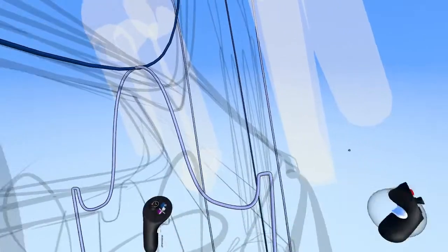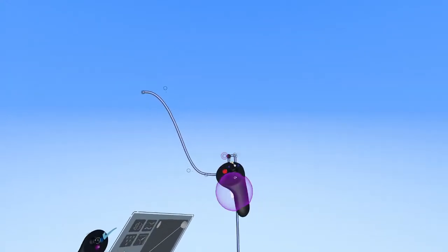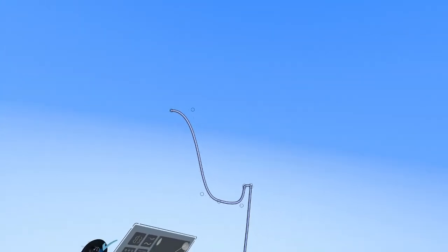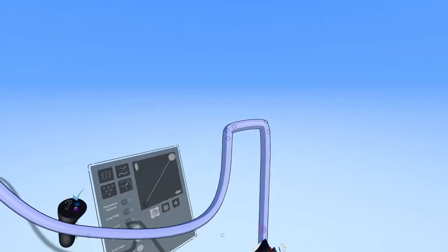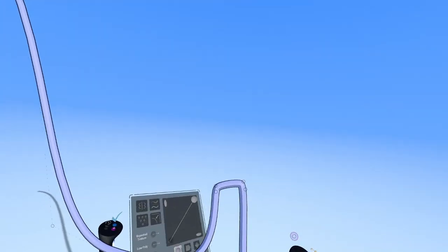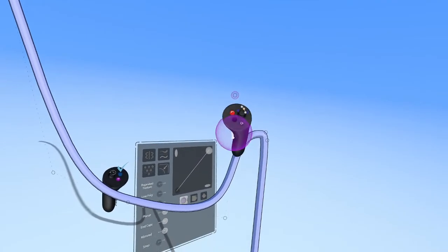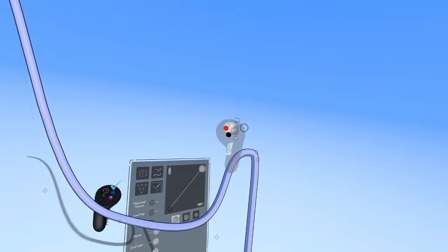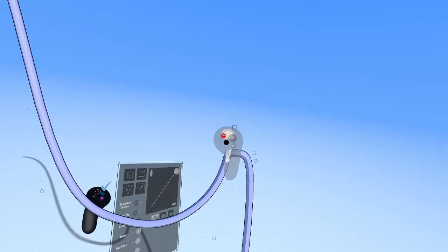And this is something that you might discover when you're doing some surfacing. Let's say you're doing surfacing from curves. So let's use this as an example here. I'll just blow this up and turn off planar. Okay, so you'll see here I wanted a little bit of a flat spot there, and it's going to need to be a tighter radius. So you can achieve a tighter radius by clicking in more edit points. That's pretty intuitive to understand when you're first using the stroke tool here. But there's another way of achieving a tighter radius, and that other way is to grab that edit point and add weight to it. The way we add weight to an edit point is by grabbing it, holding it, and going up and down on the joystick.